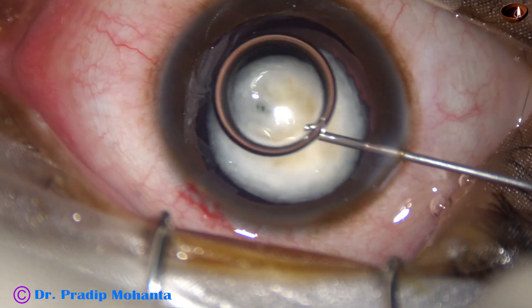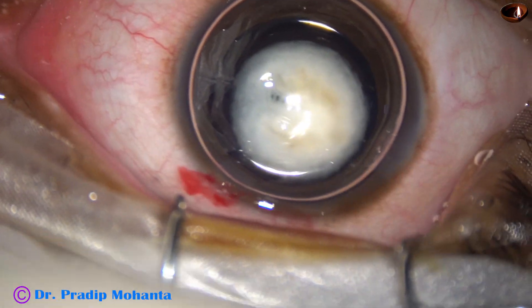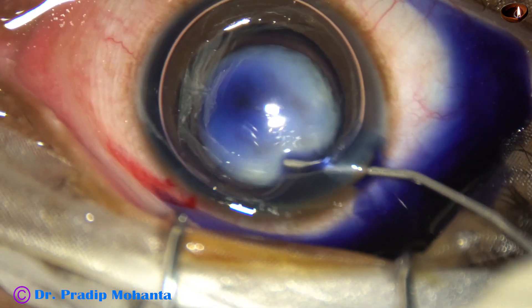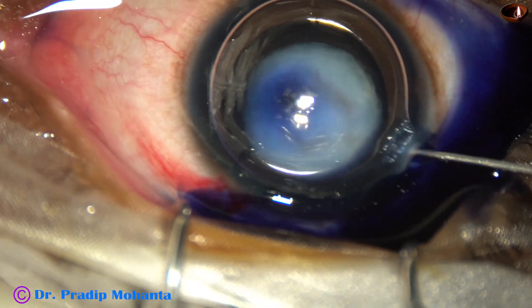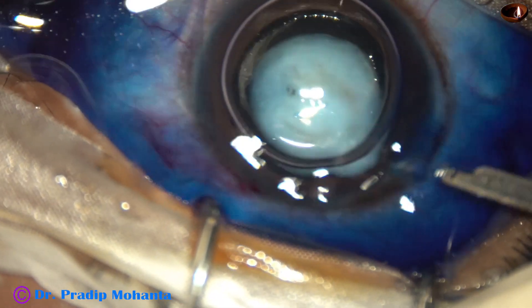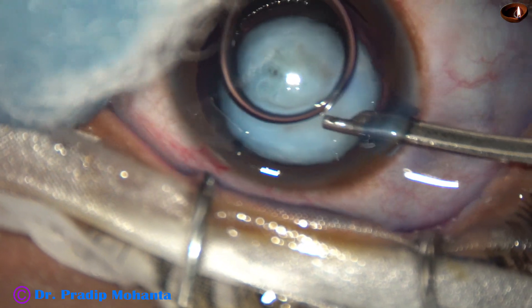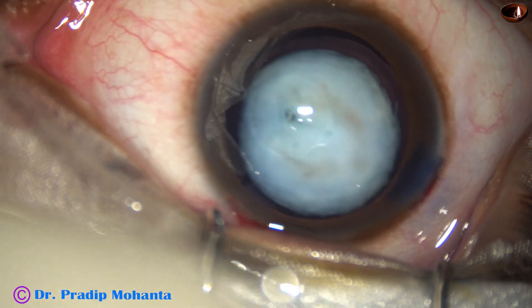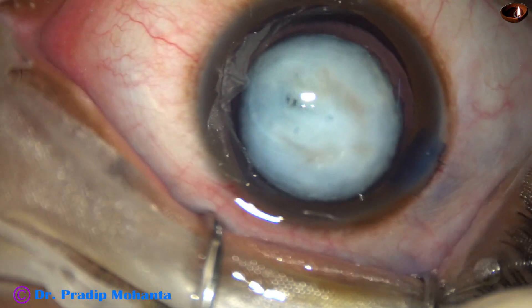And now I inject dye underneath this air bubble — Trypan blue dye. The dye stains well. You can see there is a peripheral clear zone in the capsular bag, so this is probably a developmental cataract or nuclear cataract. This is a real-time surgery, and you can see that I didn't wait after applying the dye — I started the next step. The dye is gently washed out.